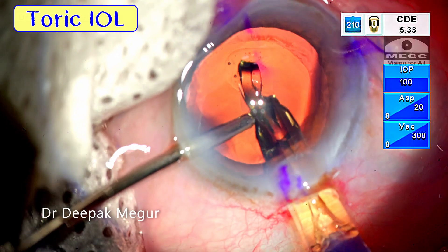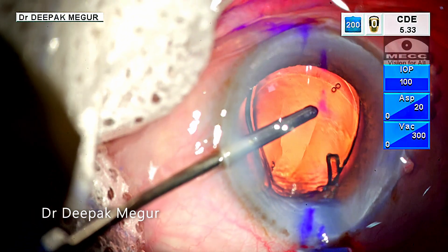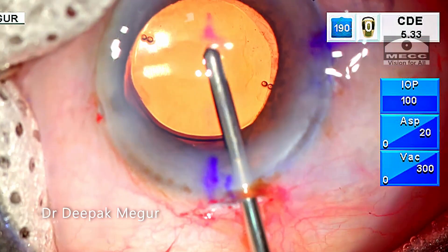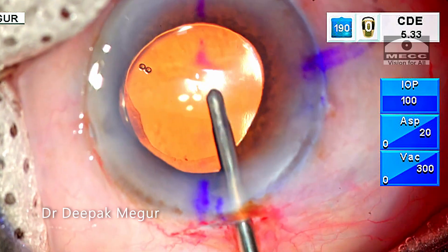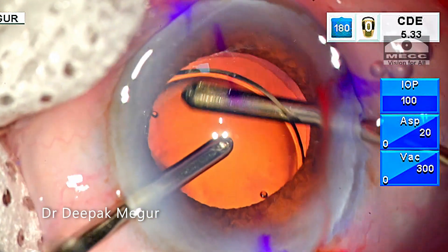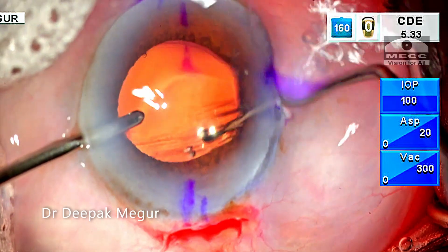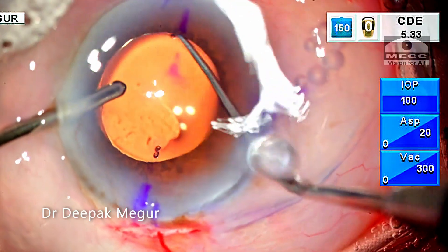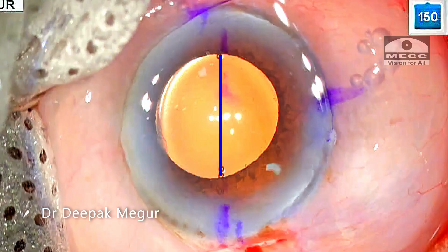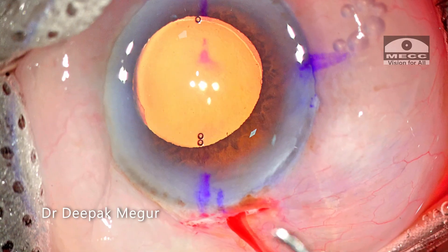Hydro implantation technique is very useful especially for toric lenses, which are mostly single piece hydrophobic lenses. Apart from not requiring extensive OVD removal, the chances of the lens sticking onto the posterior capsule are relatively higher because there is minimal OVD present. Because the lens sticks onto the posterior capsule, the chances of rotation of the lens in the early post-op period are significantly decreased. As we all know, rotation of the toric lens in the early post-op period is a significant concern for achieving the best possible alignment. So hydro implantation does have a major role to play in cases with toric IOLs.